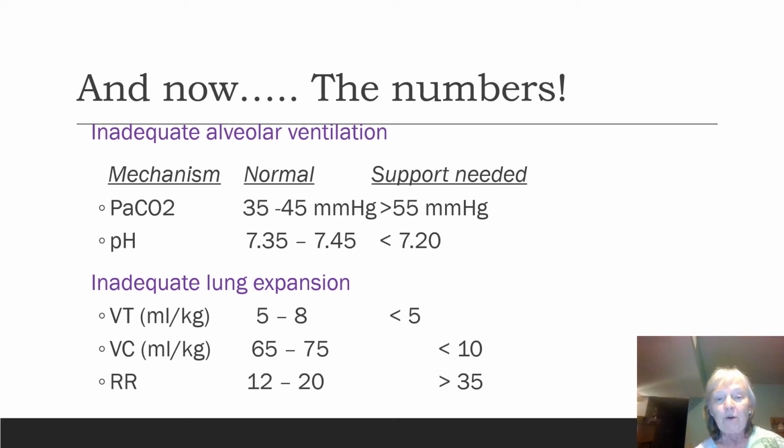So remember your formula, 106 plus 6 times, in this case 66 minus 60, is basically 106 plus 6 times 6, which is 36, and 106 plus 36 is 142 pounds, okay? We're going to take that 142 and divide it by 2.2. Divided by 2.2, you come up with 64.5 kilos, okay? I'm going to use that as a nice round center point for this one.